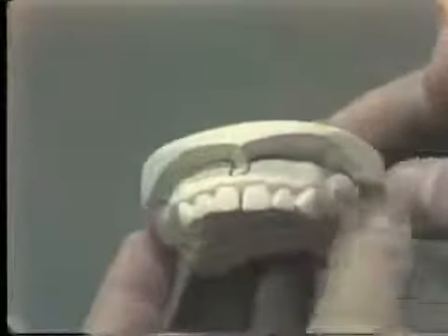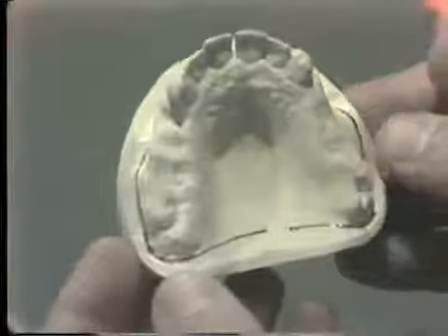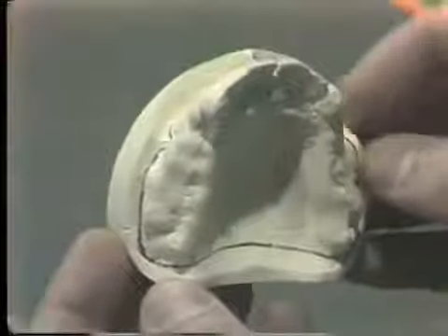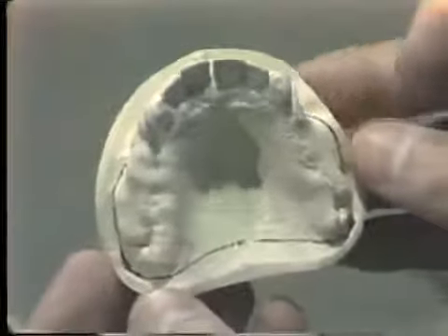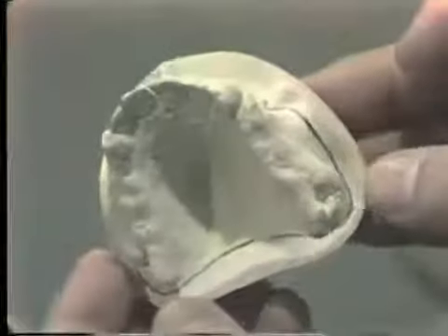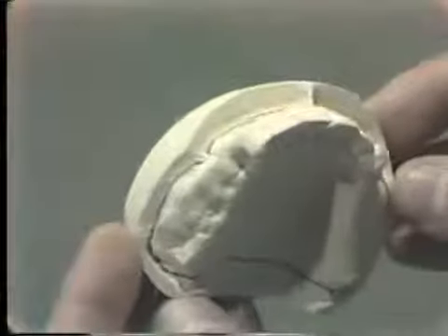Since most preliminary impressions and the models from those impressions are made from alginate, the peripheries that you see in the preliminary model are usually overextended. This means that the outline of where the denture will be should usually be a millimeter or two short of the periphery on the preliminary cast. And in this case, you can see that this outline is a millimeter or two short of the periphery in its entire circumference.